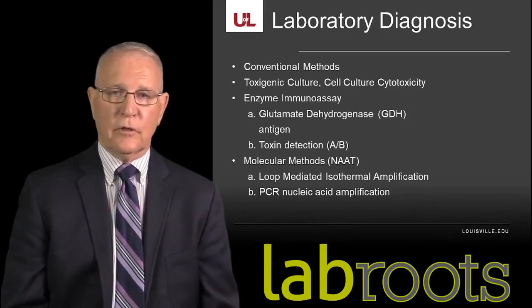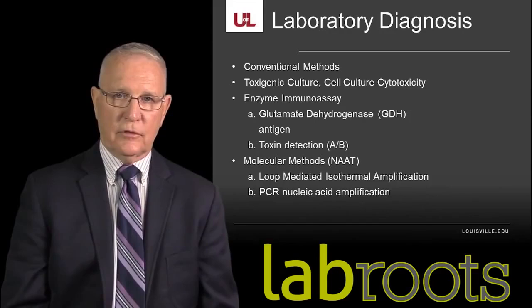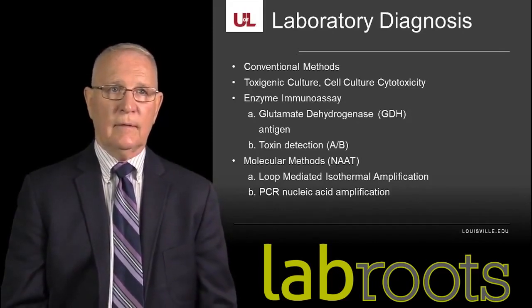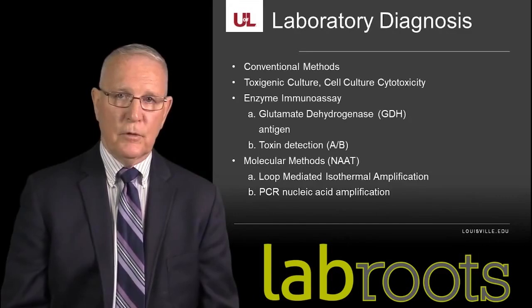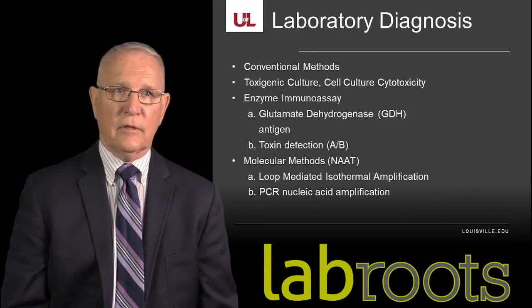And when you hear the terms sensitivity and specificity, from the laboratory perspective, we're evaluating the analytical sensitivity, specificity, etc., which does not relate to the clinical sensitivity and specificity. I think it would be a good idea if we consider reviewing the differences between clinical and analytical metrics such as sensitivity, specificity, predictive value, etc.